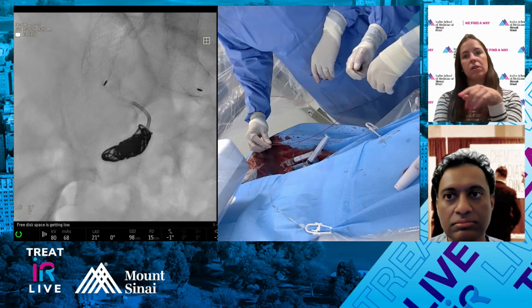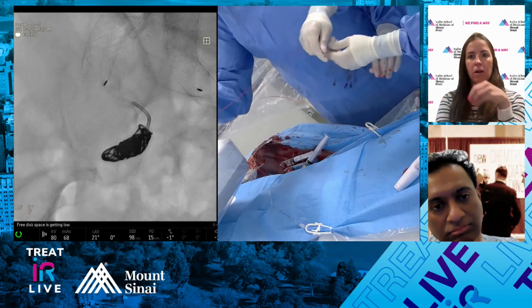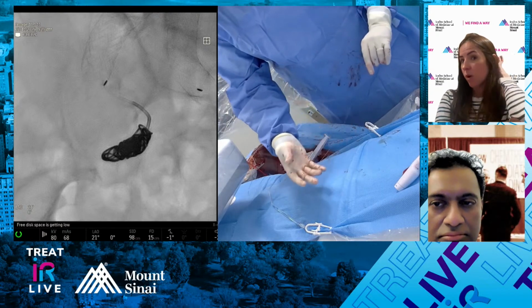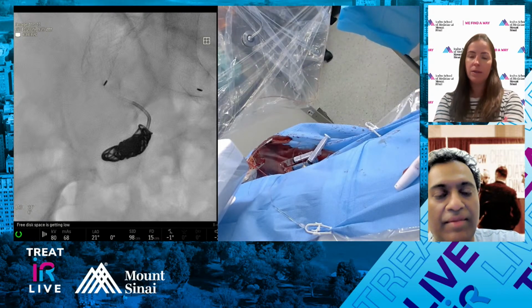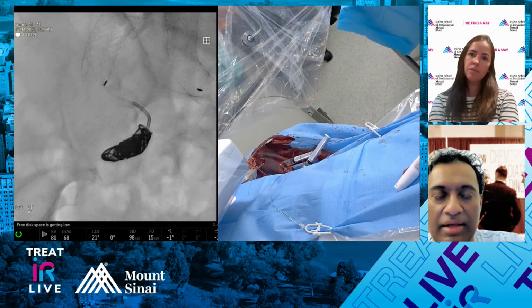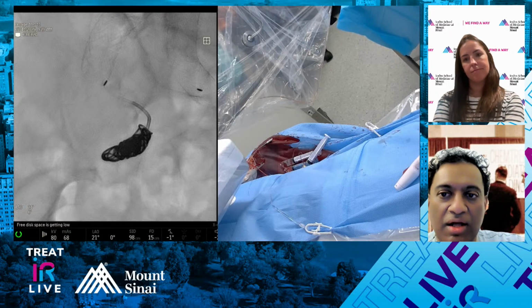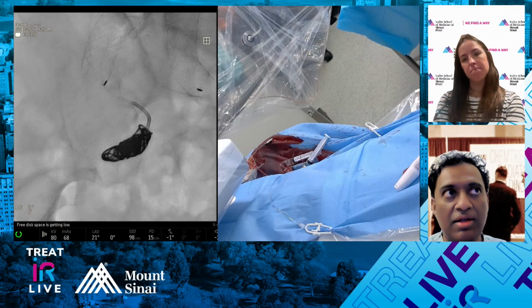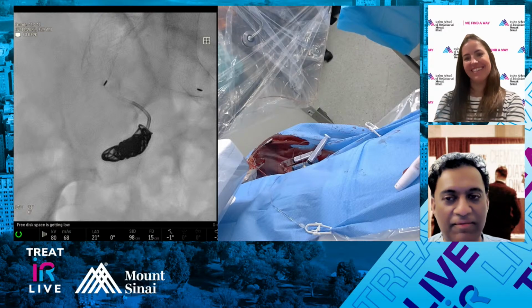And then while they're getting this ready, either Rahul or Joji, you mentioned briefly claudication. We talked about 40%. Can you just tell us what your conversation is like with your patient regarding that? Yeah, I just tell them that you will likely have butt pain. That's okay. And their family as well. After the procedure, most of the time it resolves, in my experience, in about 3 months. But it's funny, they always laugh when I say that, or afterwards, for whatever reason.